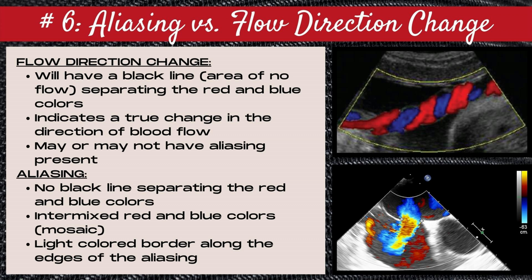The next step in our color Doppler optimization checklist is knowing the difference between aliasing and a true flow direction change. With a true change in flow direction, you're going to see a black line — this black line represents an area of no flow and separates the red and blue colors, indicating a true change in the direction of blood flow. You may or may not have aliasing present within vessels that are displaying a true flow direction change. This is represented by the top image — an image of an umbilical cord in which the umbilical artery and umbilical vein are traveling different directions, with a black line in between each red and blue color representing an area of no flow.